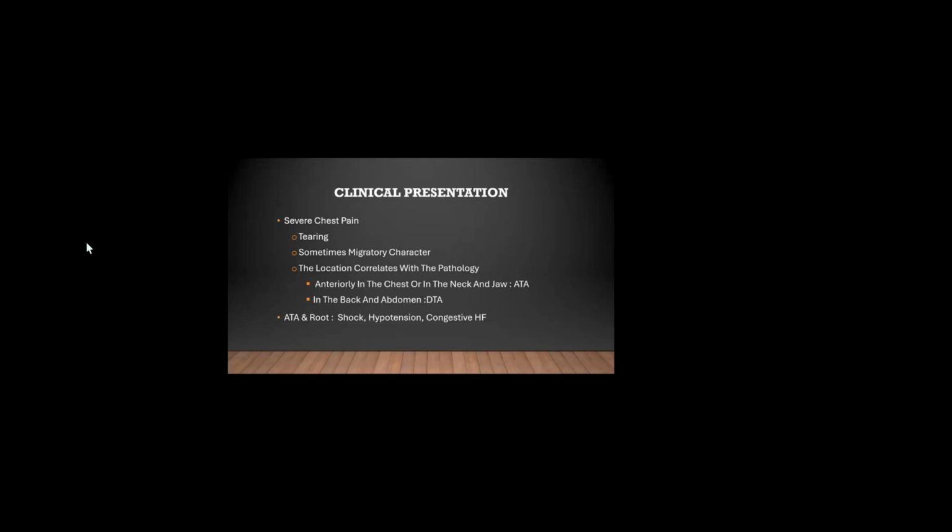In severe cases, it might present with shock or hypotension or severe heart failure signs. The modality of choice in acute aortic syndromes is CT, and that typically involves some technical aspects.